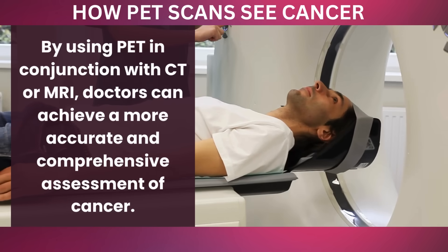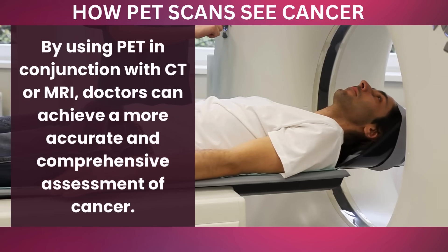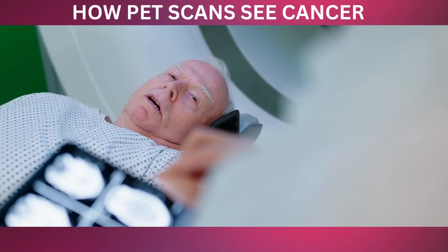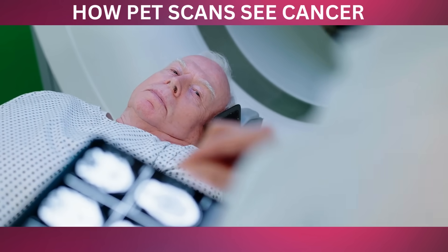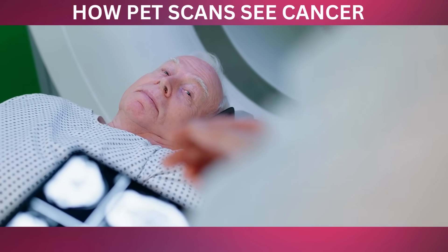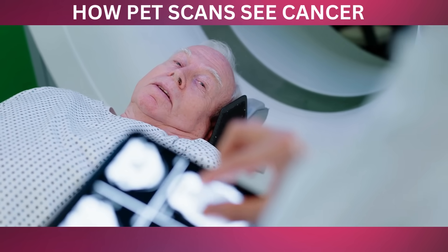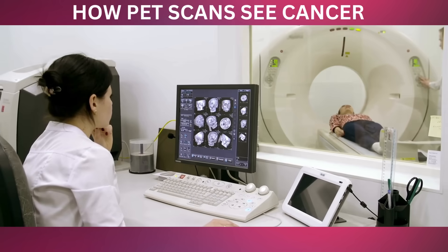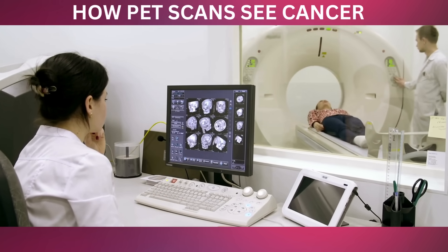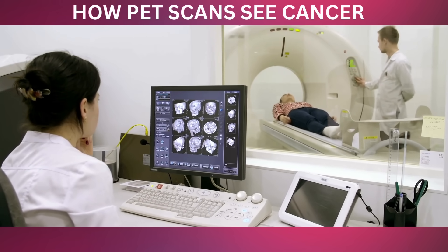By using PET in conjunction with CT or MRI, doctors can achieve a more accurate and comprehensive assessment of cancer. This combined approach enhances the ability to detect small tumors, differentiate between benign and malignant lesions, and determine the exact stage of the disease. It also helps in precisely targeting treatments and monitoring their effectiveness, ultimately leading to better patient outcomes.